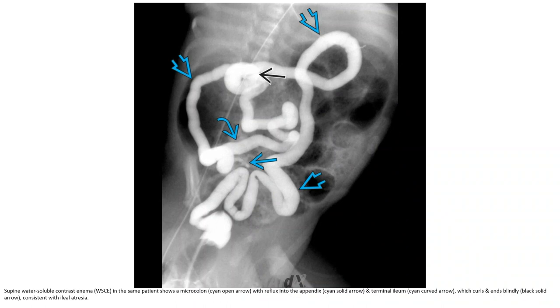In the same patient, contrast enema shows a microcolon with reflux into the appendix and terminal ileum, ending blindly, consistent with ileal atresia.